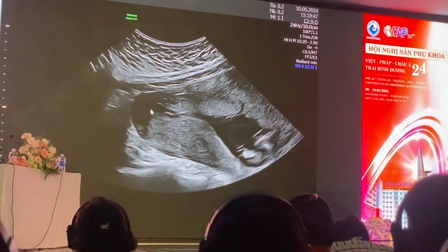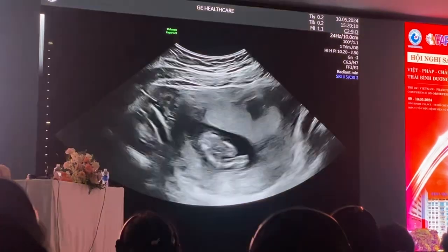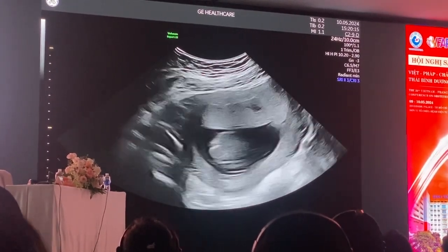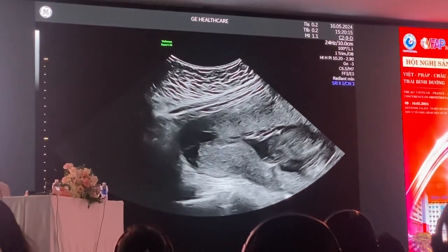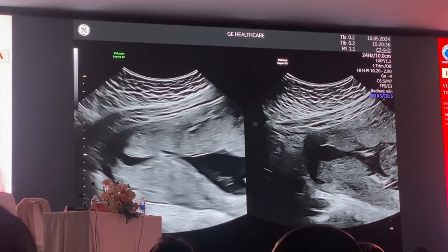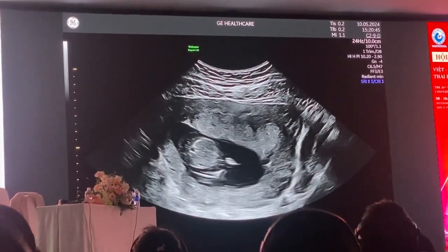Stuck. Do you think that froze it? Try and finish it. You can't see it really, it's not reading the USB document. Okay. So then do a longitudinal sweep. It's still increasing. Sorry, just having a few technical problems. So I'm going to start again. Okay. Just bear with me for 1 second.